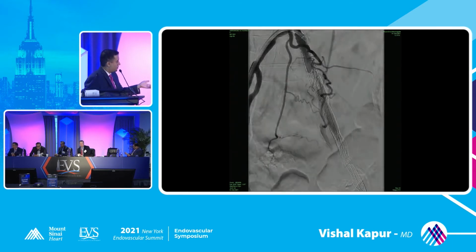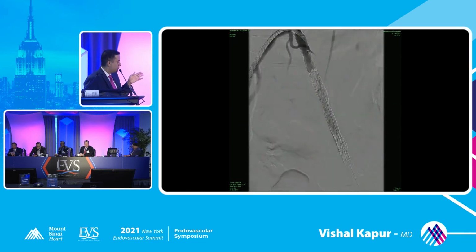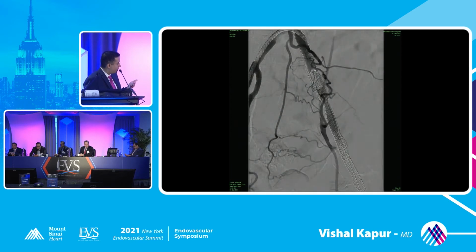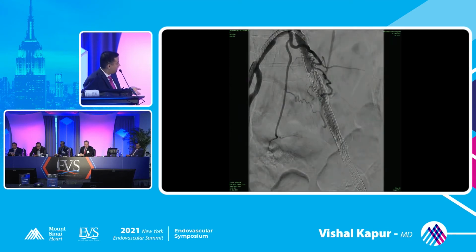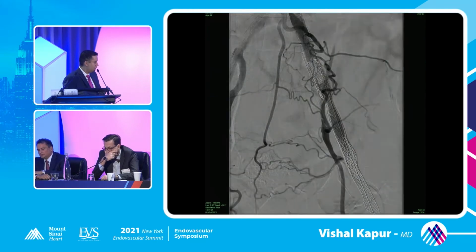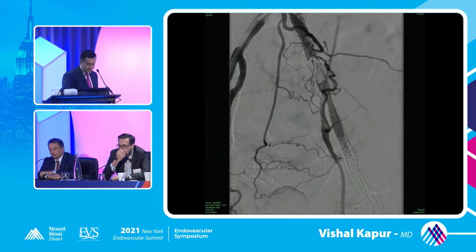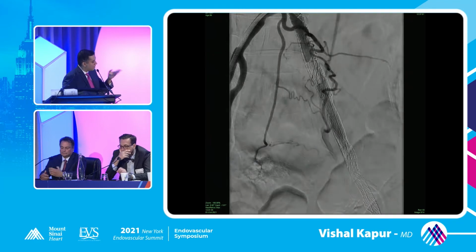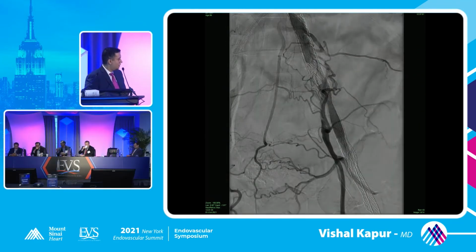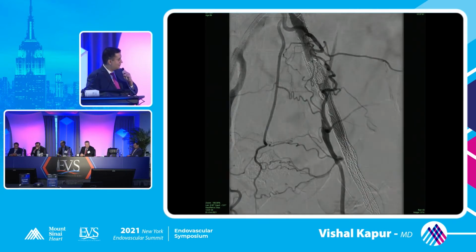Could be fibrotic tissue as well, which I displaced, overlying thrombus, or because my repeat ACT was 221, 220, maybe, I don't know if she had some underlying issue, but it wasn't there to begin with after I did my first balloon angioplasty and after I put my external iliac stent. Because when you injected is when it went down, and Dr. Ferris is probably right. It might have been something from within the stent that was just going down. Chronic clot, certainly, but probably not acute thrombus. It's not something that formed at this time. Your ACT was okay, but iliac disease, even without in-stent restenosis, is notorious for this, and in-stent restenosis is even worse.